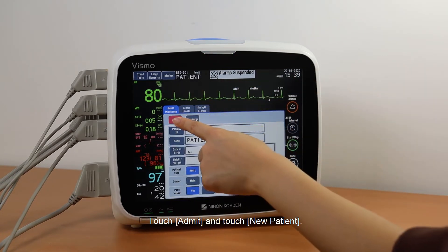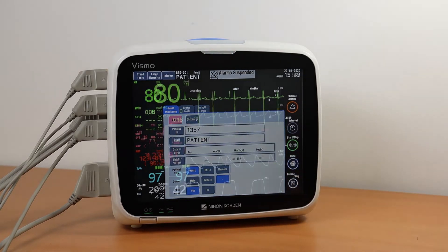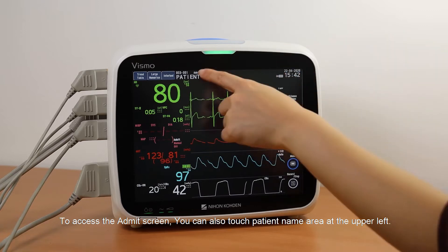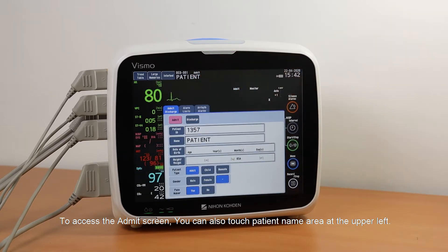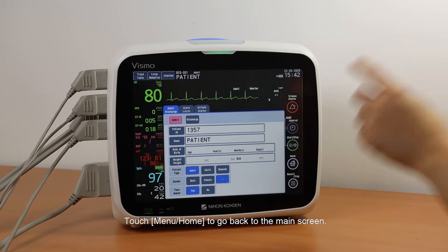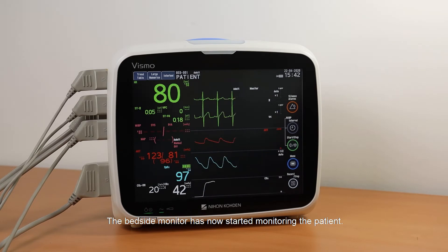Touch Admit and touch New Patient. To access the Admit screen, you can also touch the Patient Name area at the upper left. Touch Menu Home to go back to the main screen. The bedside monitor has now started monitoring the patient.